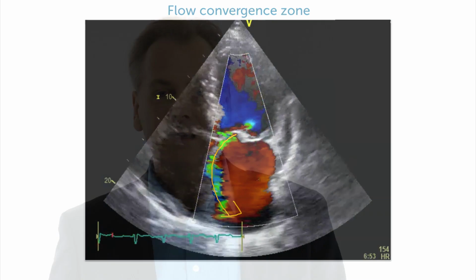Now, my estimate would be this definitely is severe mitral regurgitation, and it is probably his main problem. And there's another finding, but we'll talk about that finding later. First, I want to explain why this jet is severe even though it doesn't look as if it's severe.